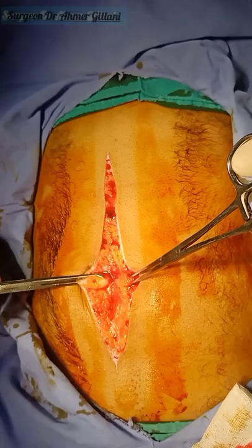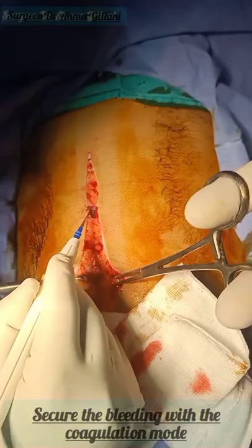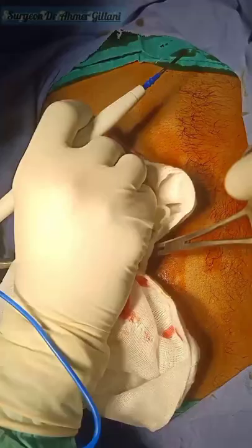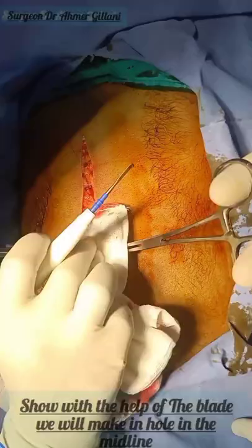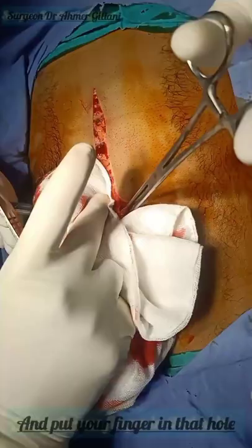The unipolar cautery has two modes: cut and coagulation. You will use the coagulation mode to secure the bleeding. We are securing the bleeding with the help of the unipolar cautery using its coagulation mode. After that, we will proceed from the midline and make a hole in the midline around the umbilicus so that one finger can be placed into this area, and we will coagulate that area above our finger.